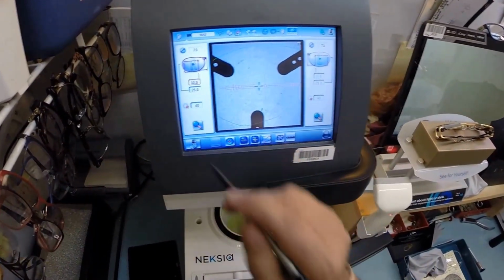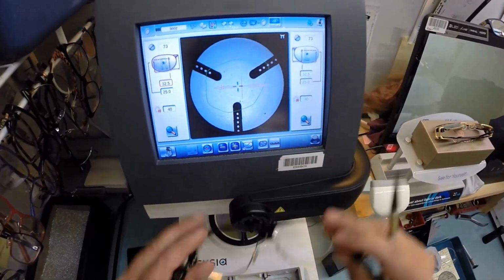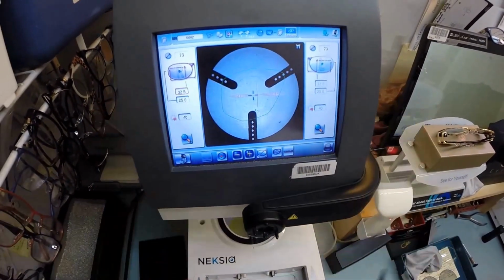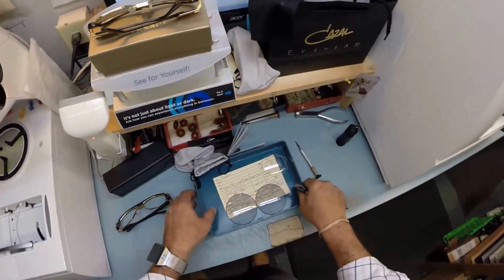That is the size of your lens magnified. If I bring it down to actual size, that green outline that you see is the shape of the lens that we will be cutting. I will magnify it as I work on it. I'm going to set this down for here. Let's go ahead and get your lenses ready now.